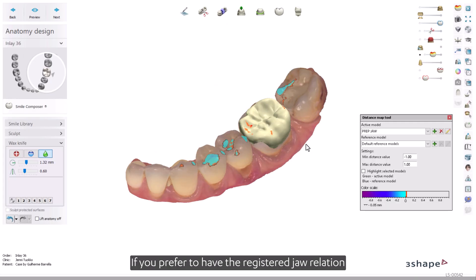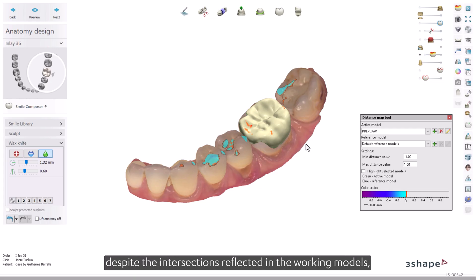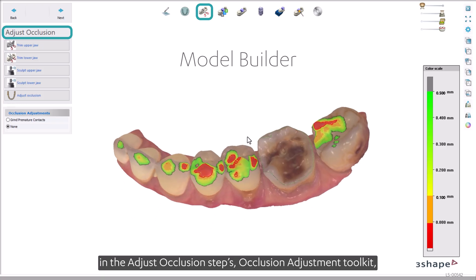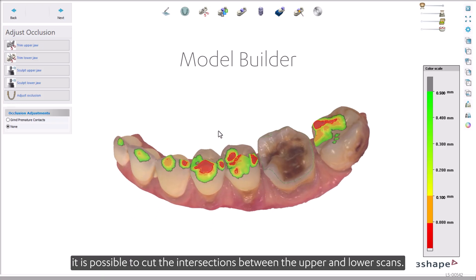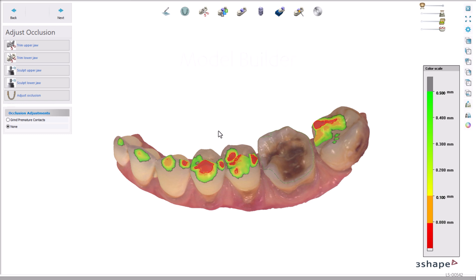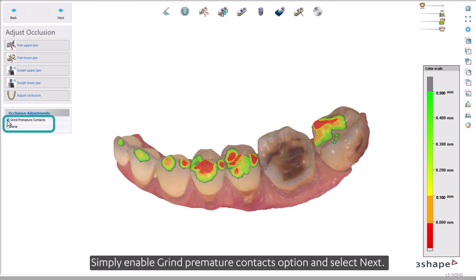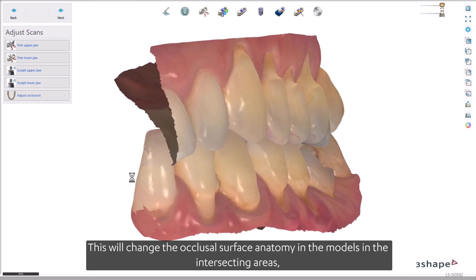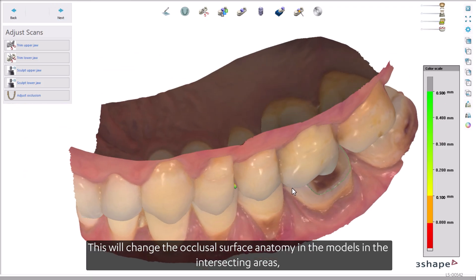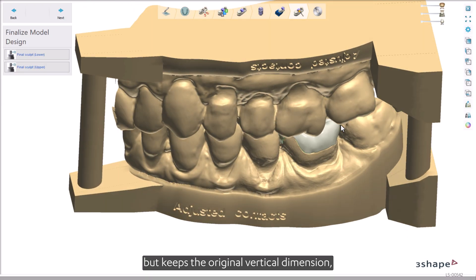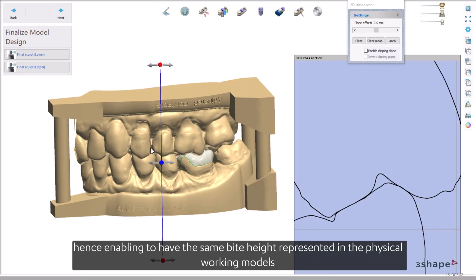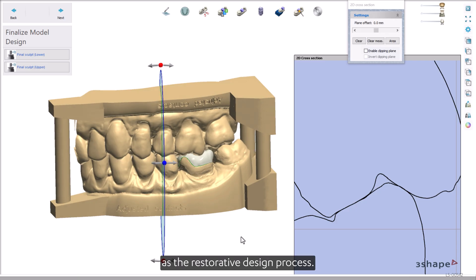If you prefer to have the registered jaw relation despite the intersections reflected in the working models in Model Builder, in the Adjust Occlusion step's Occlusion Adjustment Toolkit, it is possible to cut the intersections between the upper and lower scans. Simply enable the Grind Premature Contacts option and select Next. This will change the occlusal surface anatomy in the models in the intersecting areas, but keeps the original vertical dimension, enabling the same bite height to be represented in the physical working models as in the restorative design process.